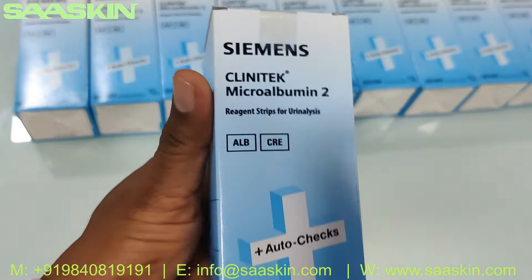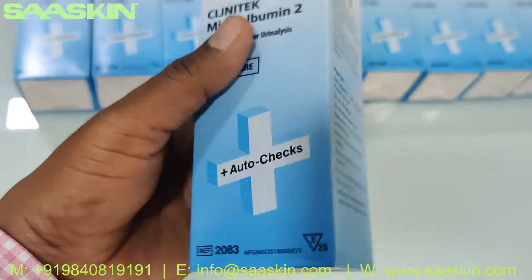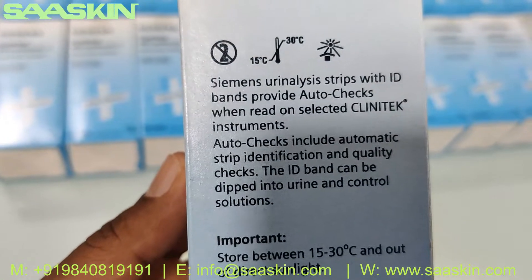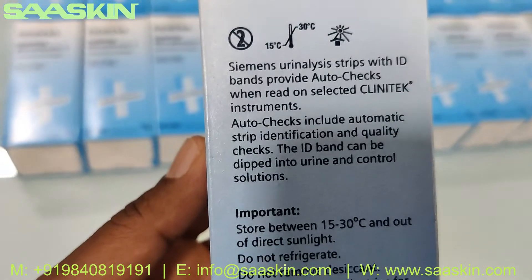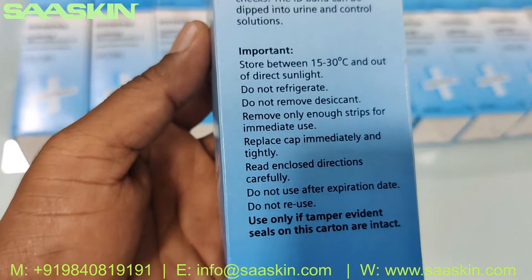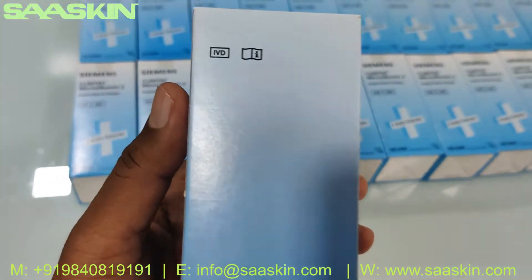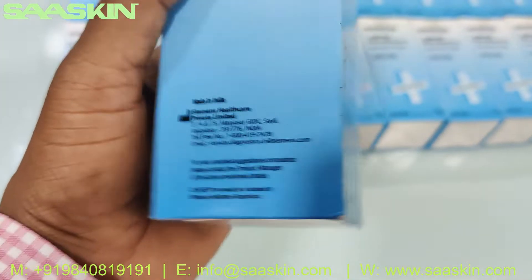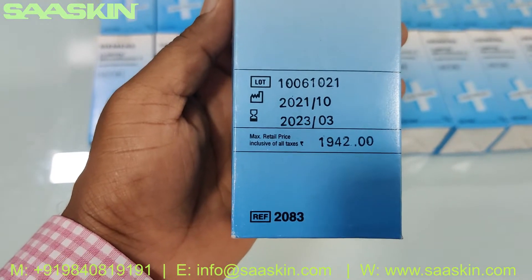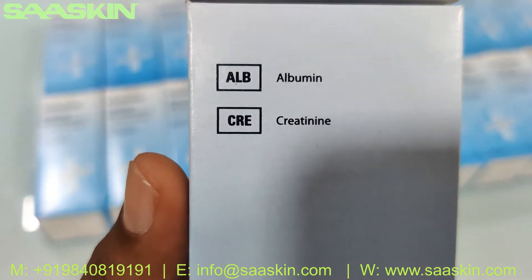Inside the box there are 25 strips in a bottle. It is Siemens urine analysis strips with ID bands that provide auto checks when read on selected Clinitek instruments. You can store it at room temperature. It is from Siemens and has one and a half years of validity. This is for albumin and creatinine.